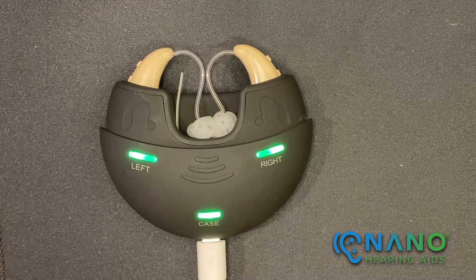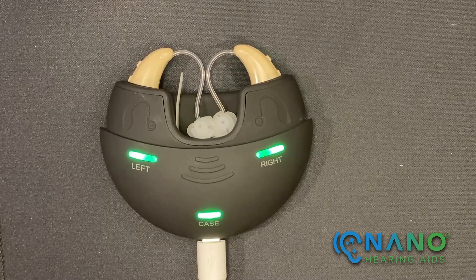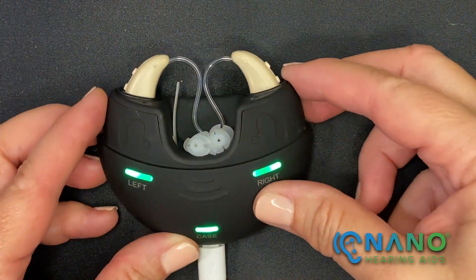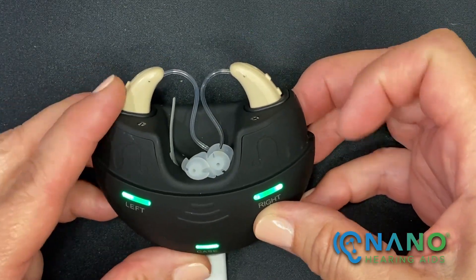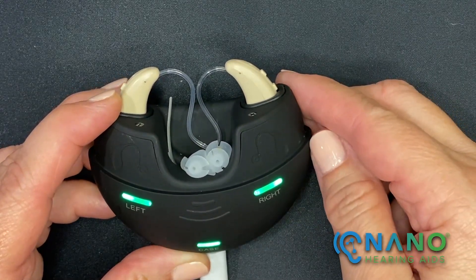How do you know which aid is for the right ear and which aid is for the left ear? With the case in this position, you'll find the right hearing aid is on the right side and the left hearing aid is on the left side. Both thin tubes and domes are in the center of the charging case.